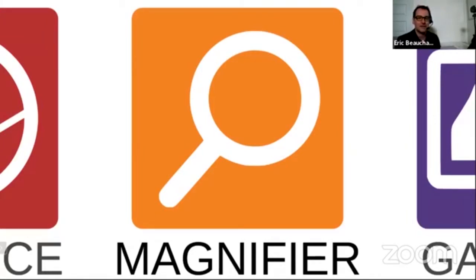We're going to share some really cool features that were added in the new version of the Prodigi software that works with the Connect 12 and the Reveal 16i. But also we're here to answer all your questions. If you're having a problem with any low vision devices from HumanWare, we're here to answer your questions. With me today, Natalie Réaume is the product manager for low vision devices at HumanWare.